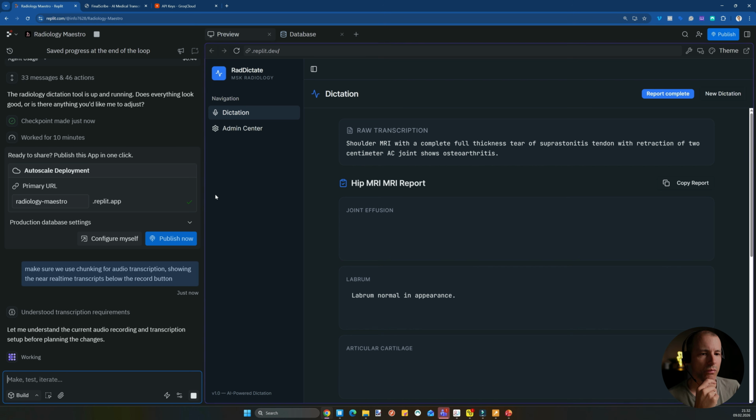Okay, so this was working. So now that's good. This is now the app would be ready to share. We don't want to publish now. We first want to finish this. And now I told it to make sure we can actually see what we are transcribing in real time or near real time. That should be the goal now. So let's see if this is working.